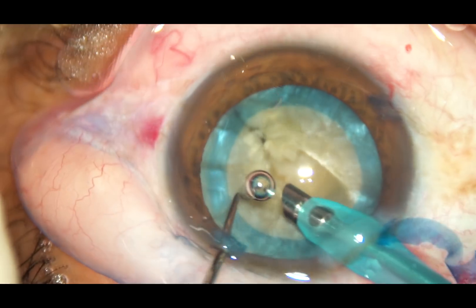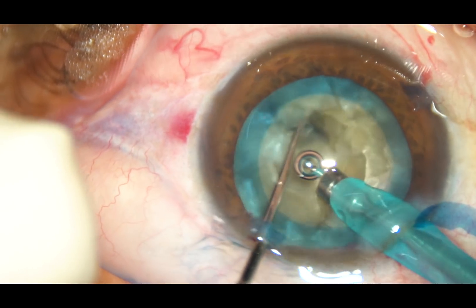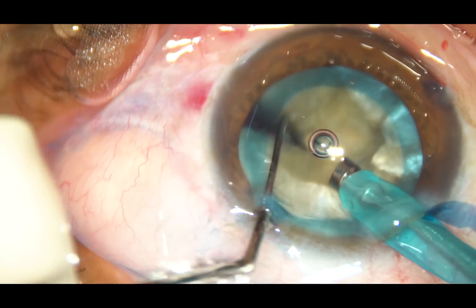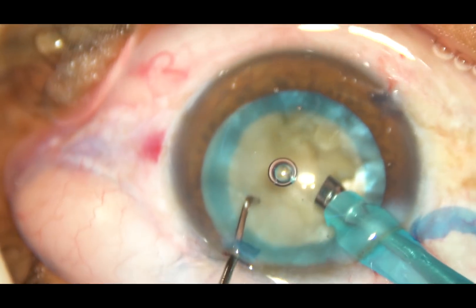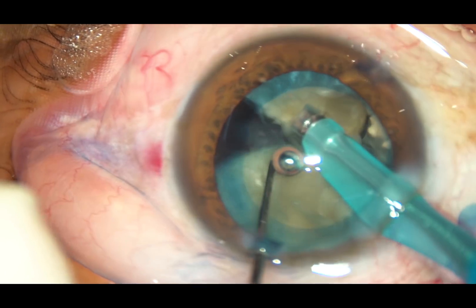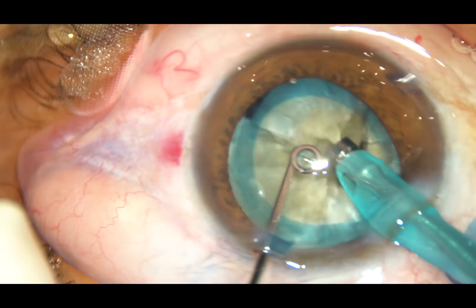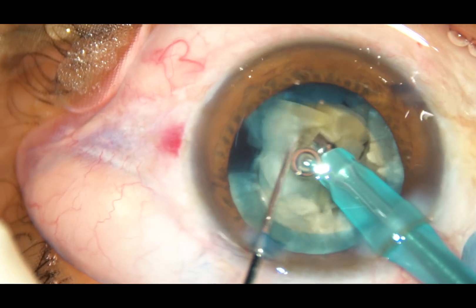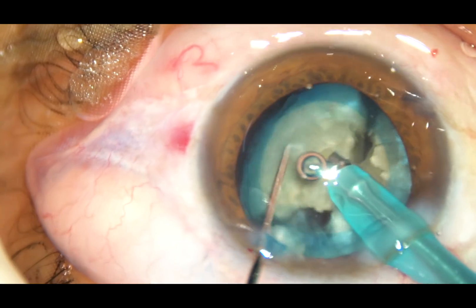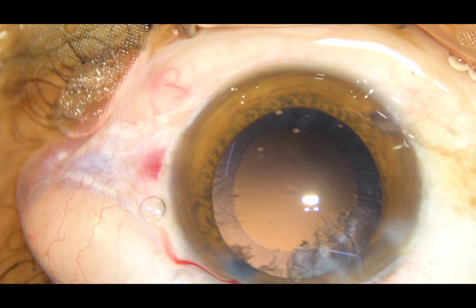There are two air bubbles. The nucleus is rotated and it is chopped at another place. It is rotated again and the other hemi-nucleus is held with vacuum and it is also chopped. Rest of the nucleus management is going to be edited to shorten the video. The FACO power being used in this case is 65 to 70 percent, flow rate is 45 ml per minute, and vacuum is 450 mmHg.